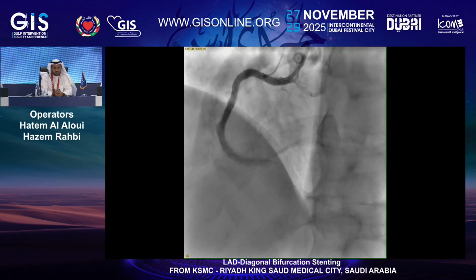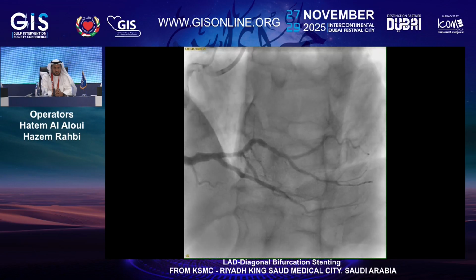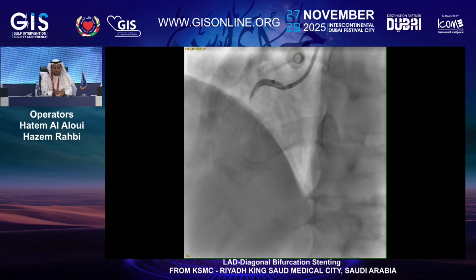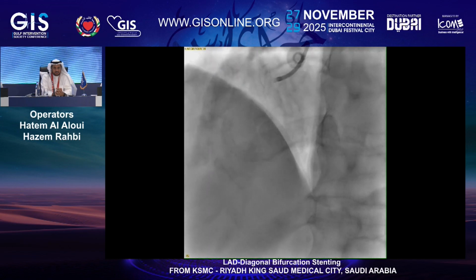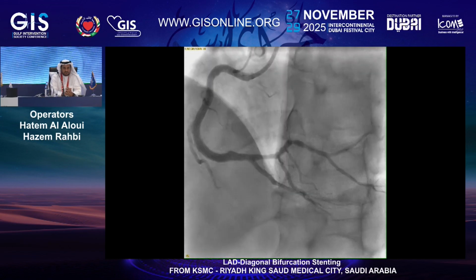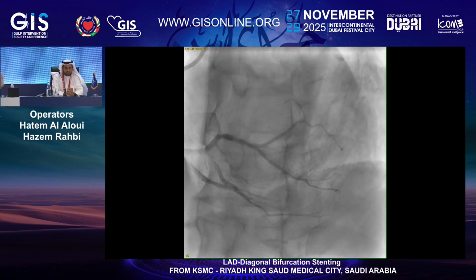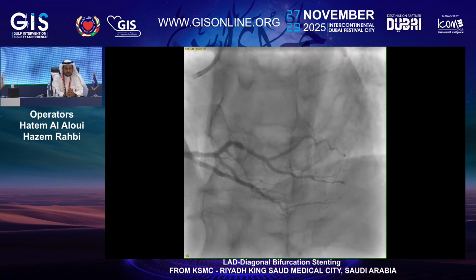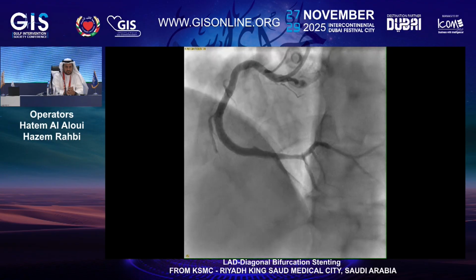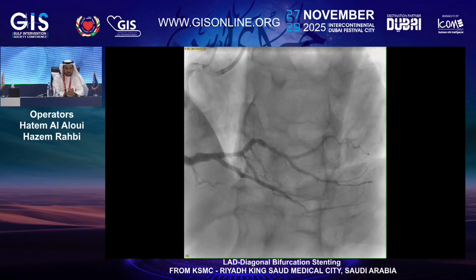And this was the result. As I said, it was a quite nasty, thrombotic lesion, so we had some slow flow at that time, but as you see, the result was excellent at the end. So the decision was to deal with the bystander lesion in another setting, not during the same setting.